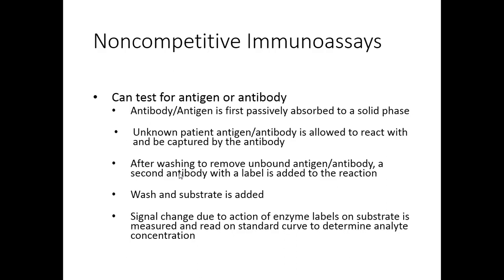the antibody that was bound. So it's antibody to an antibody, which is unique. The FC region is an epitope. It's an antigenic site for that second antibody. So we're going to add a second antibody that has the label. We've created a new complex. We've created an antigen-antibody-antibody complex, for example.